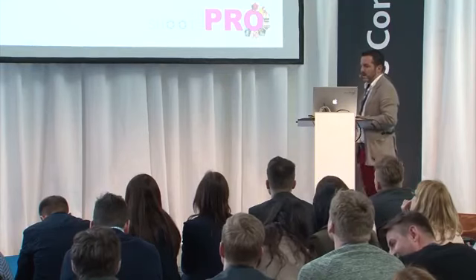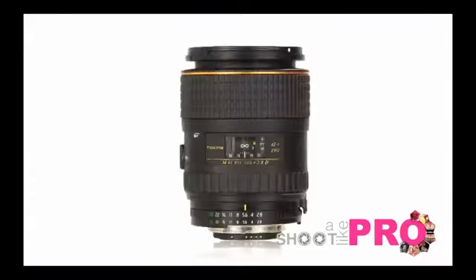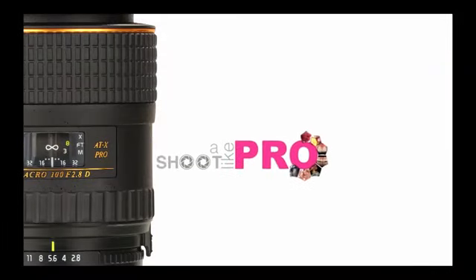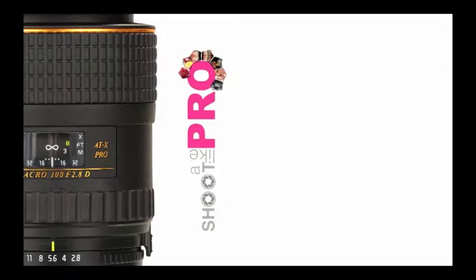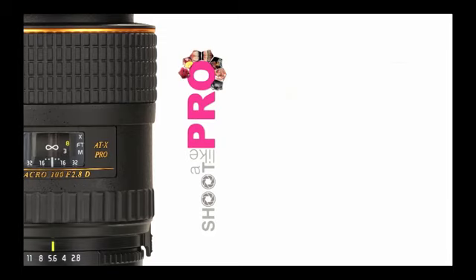And then I will tell you which lens I'm using. I told you I'm using only one lens for all my photos. It's the Tokina 100 millimeters. Yeah. I use this for cross polarization, for intraoral, for laboratory, for portraits, for close-ups, you name it. I never change the lens on my camera.